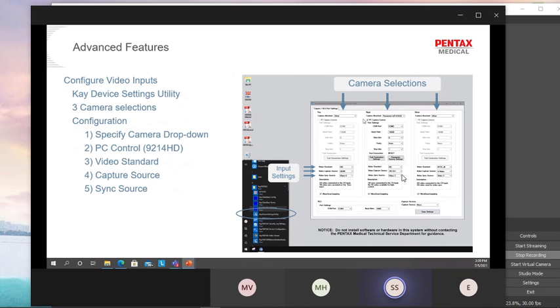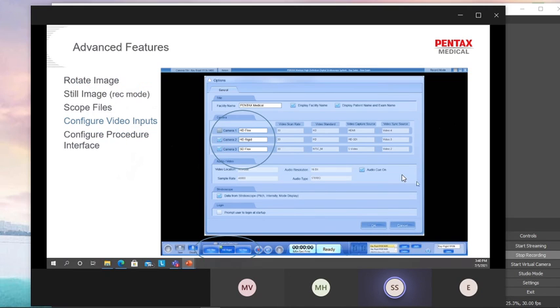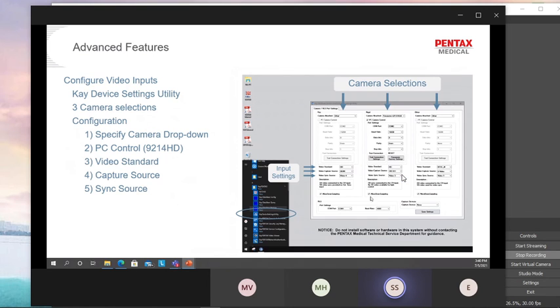So you have the hardware part. Then you have the 9372 KDS communication settings utility to take note. And then this is your KDS application. All right. So once this is set properly, this will follow these settings here.